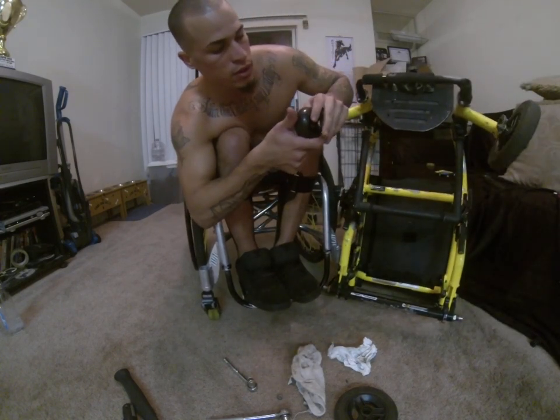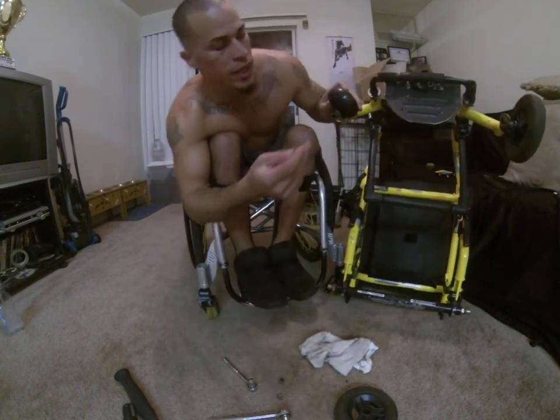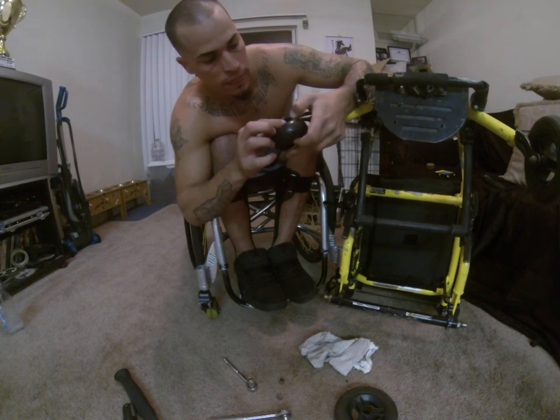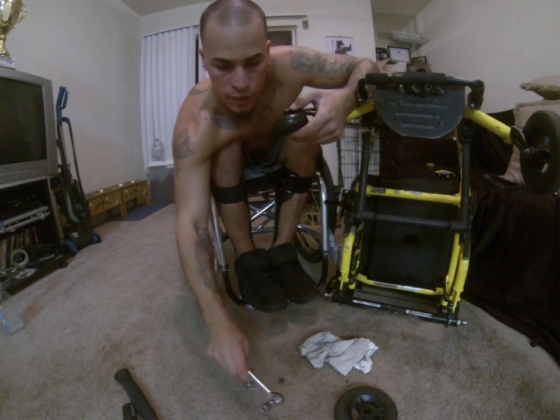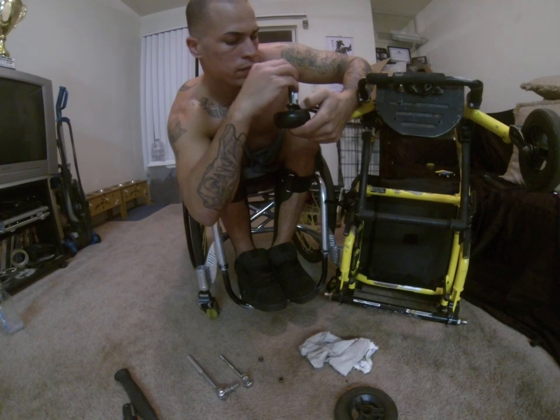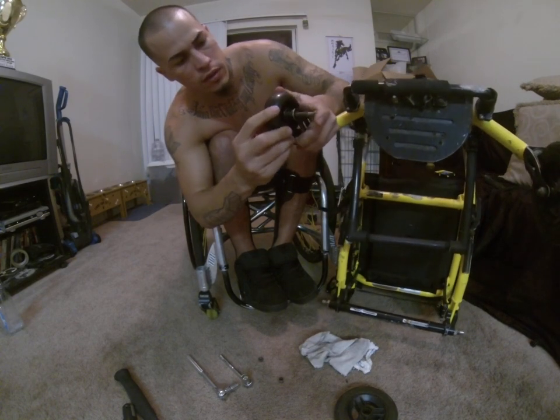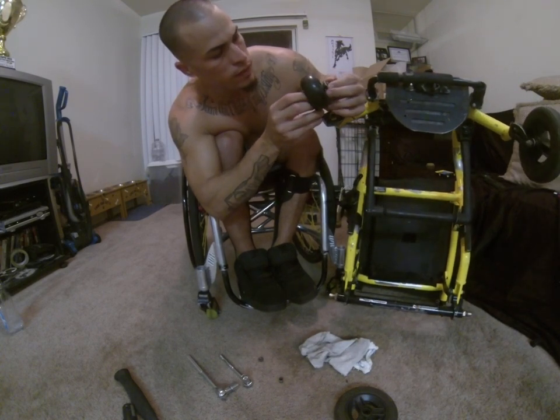So here we go. You're gonna do the same thing now. Putting it back in. Everything's the same, just backwards. You're gonna put these spacers right back in between there, and then you're gonna bolt it down. You got one. Now you gotta find the place of it where it fits. There we go. And then you gotta put the other one down.